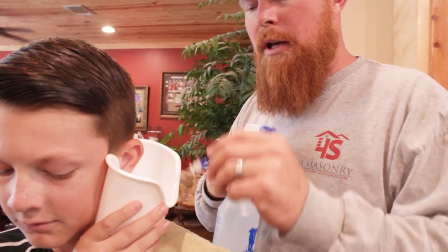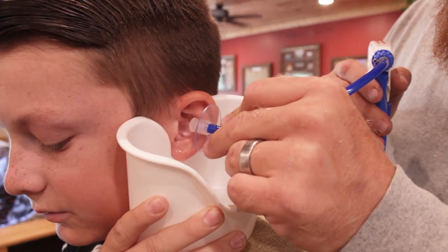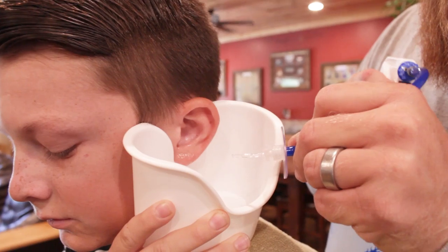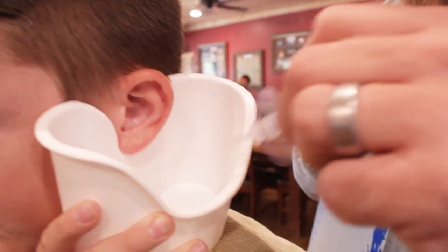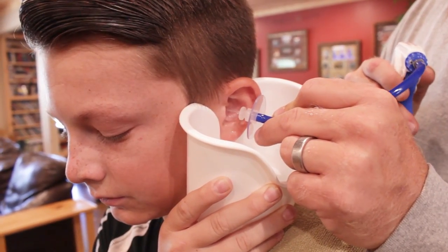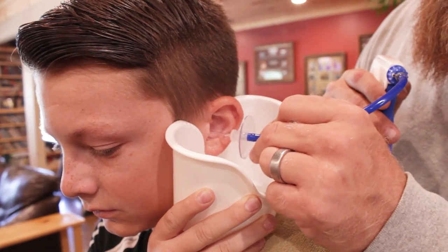I mixed it together and it's already ready to go. We're going to put it into his ear and start squeezing. I want you to close your jaw. Put it inside and slowly start to squeeze it. That small little jet does a really good job at moving any ear wax around. You just angle it around as you're squeezing. There's a little shield here to protect your fingers from the fluid coming out.